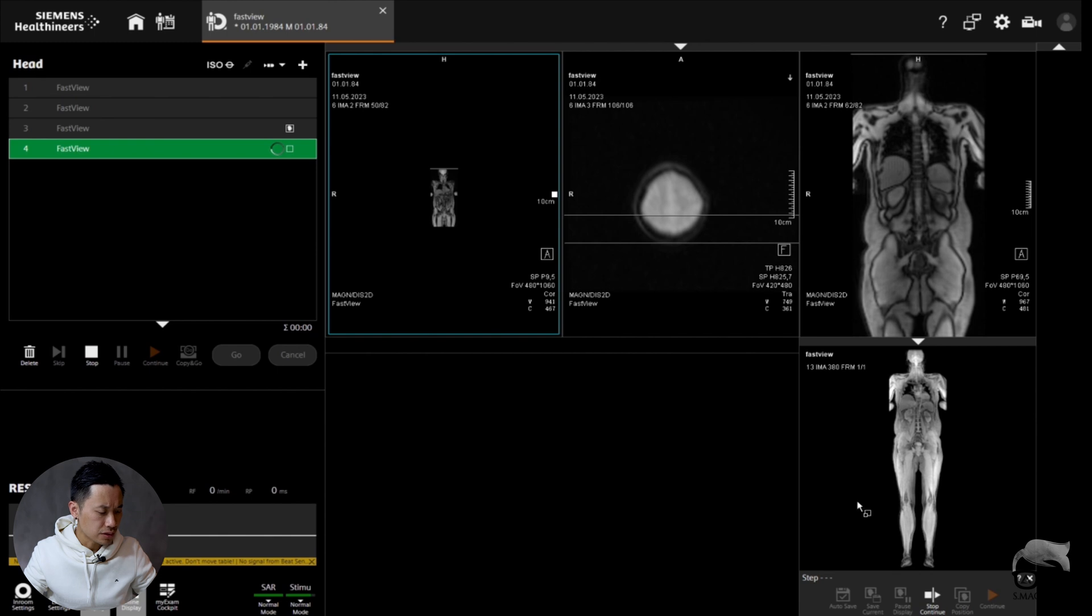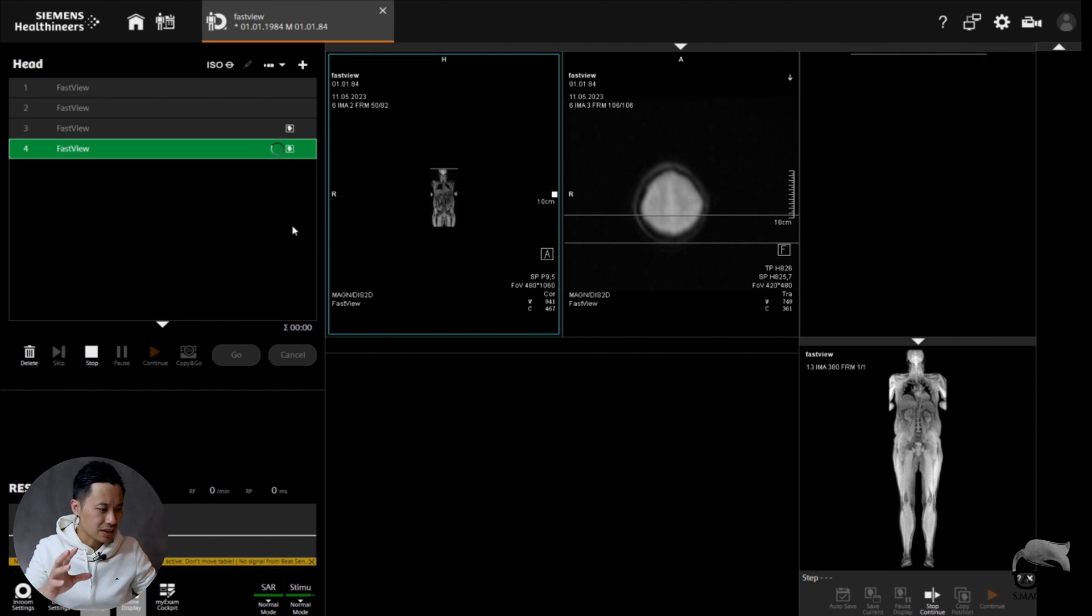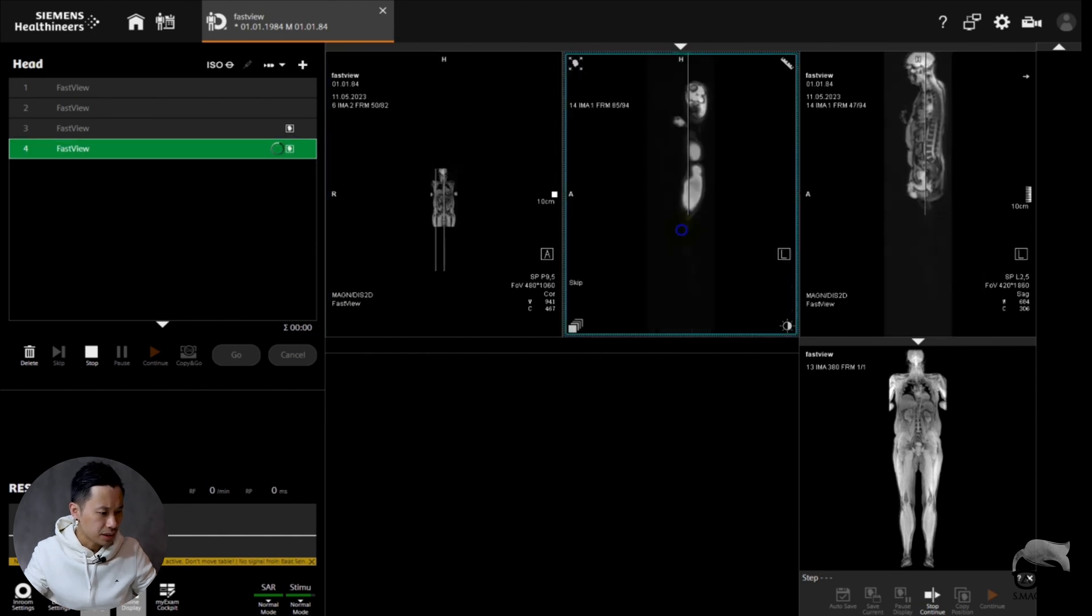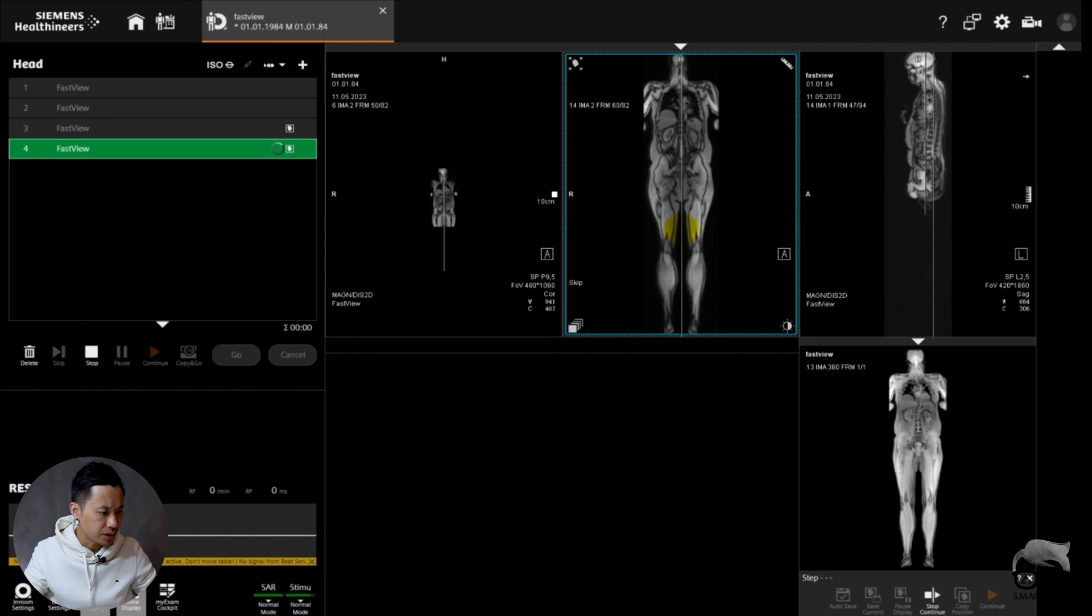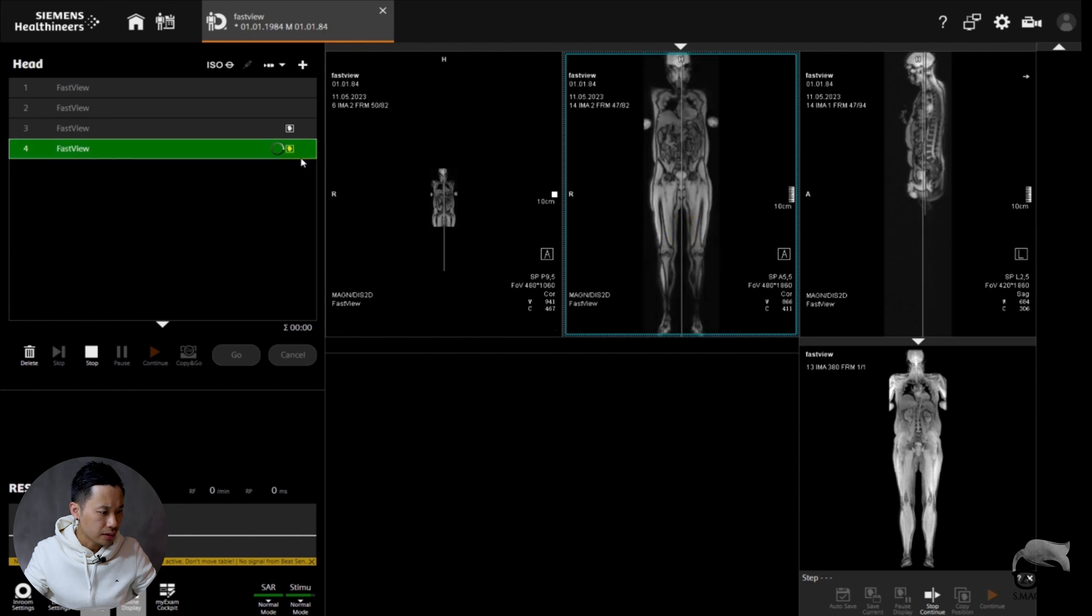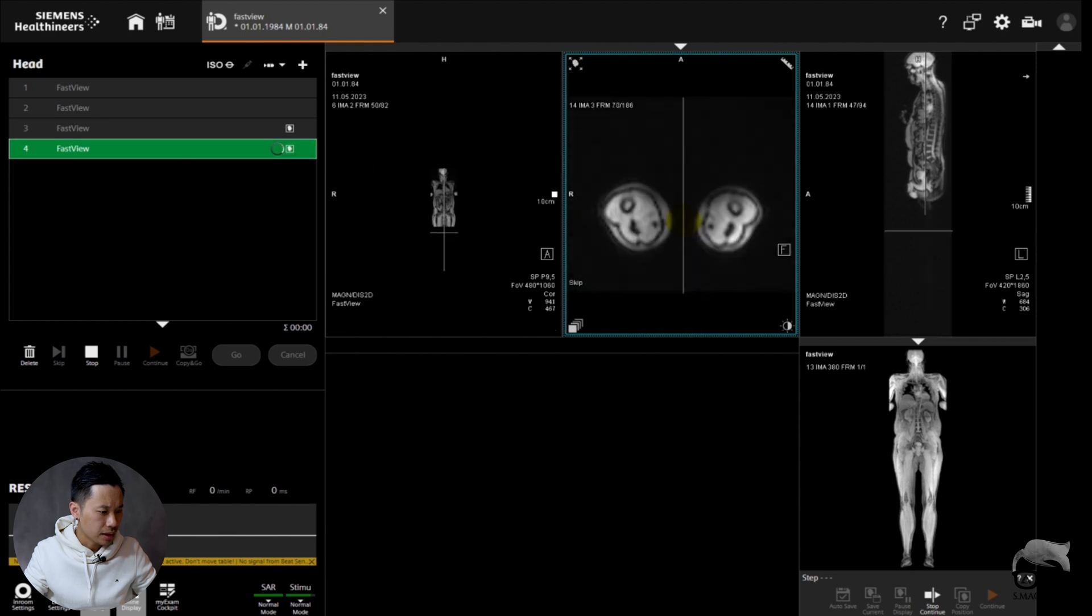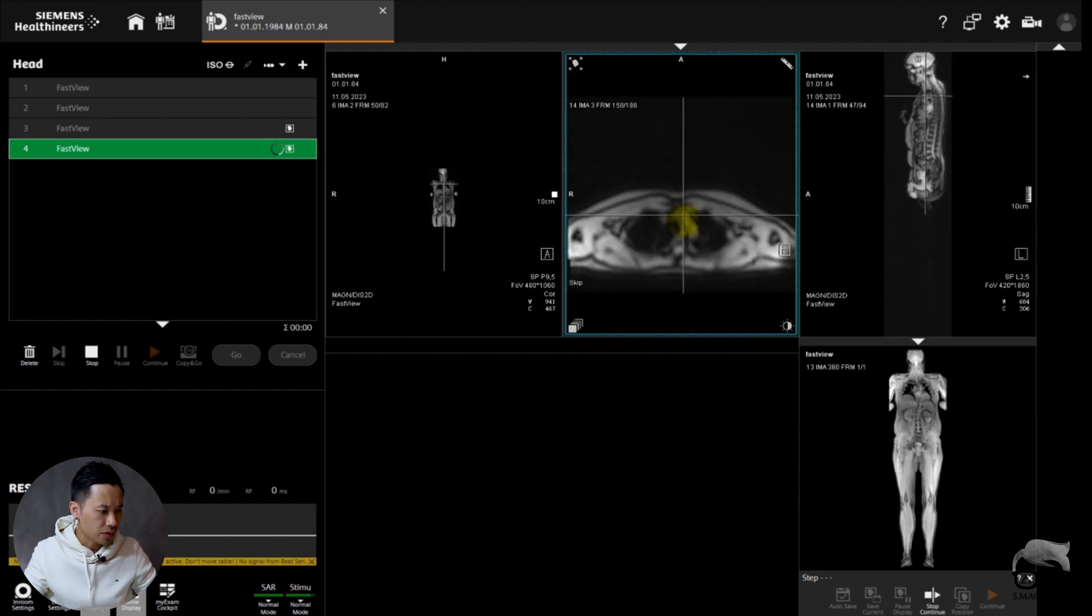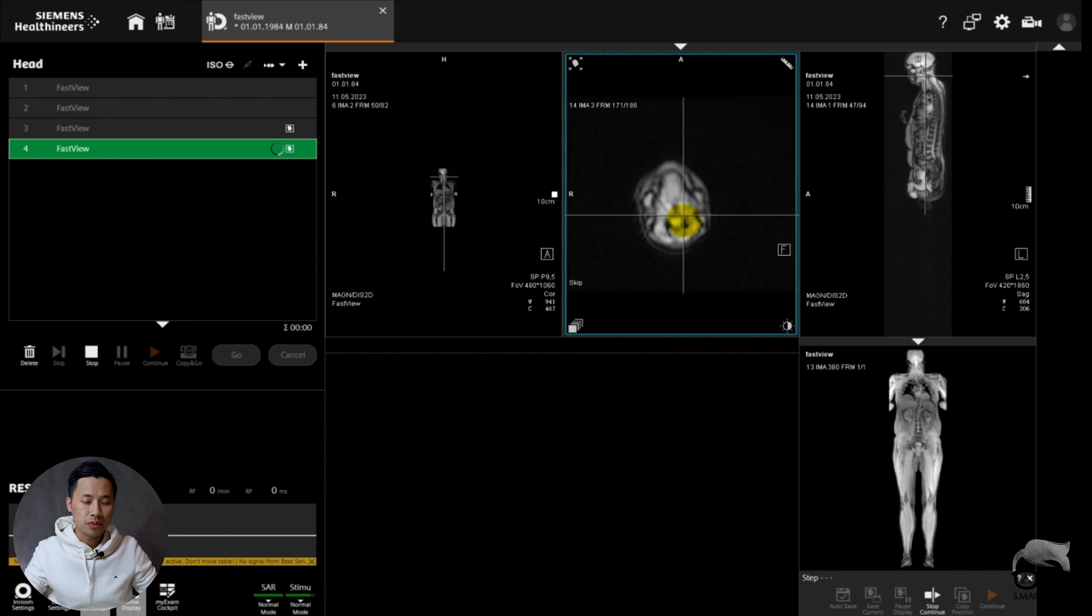You can see I have the opportunity to scroll right here in transversal all the way, which is awesome. It's a great overview and it's fast.